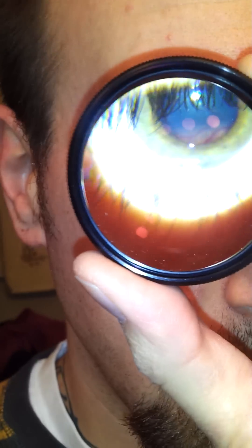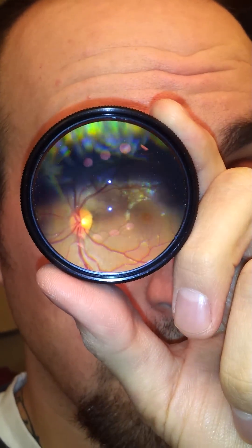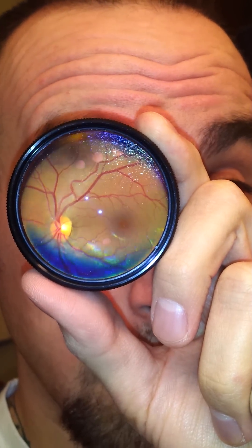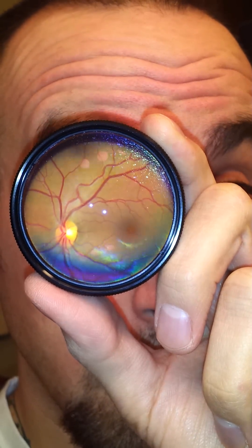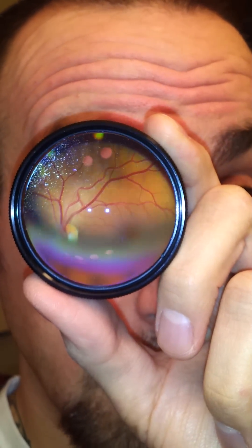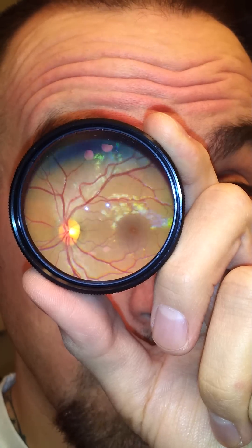The hardest part is getting the working distance set up right. I'm going to put my lens up and I am looking at the reflection in the mirror so I can see where to line up and get everything at just the right distance. And there you have it — you can see the macula and the optic nerve. Any little movements I make I can compensate because I can see the reflection with my non-dominant eye.